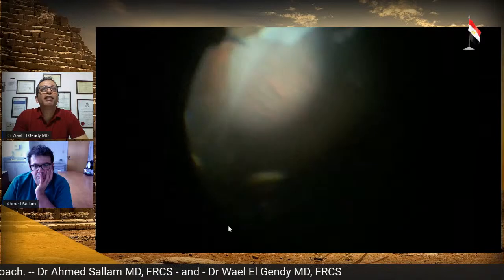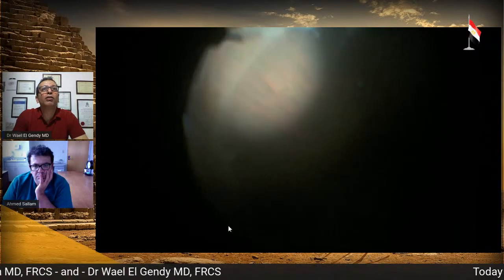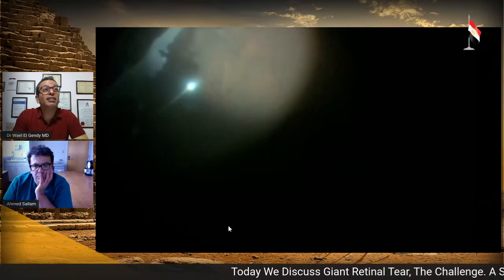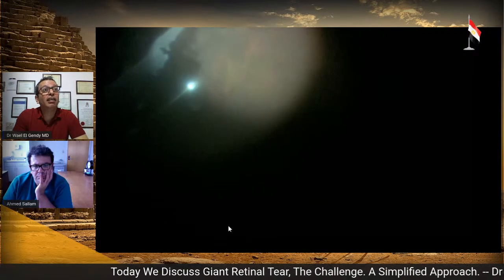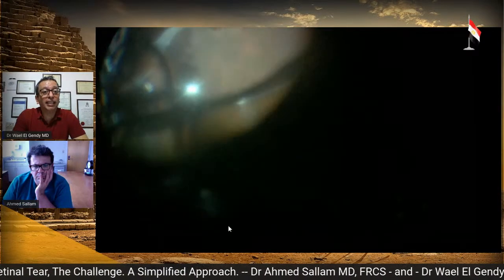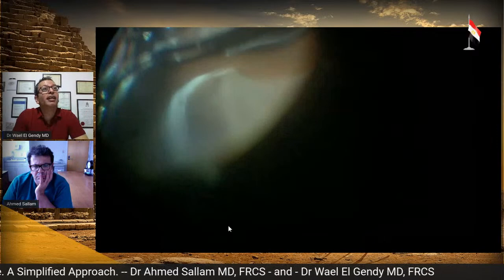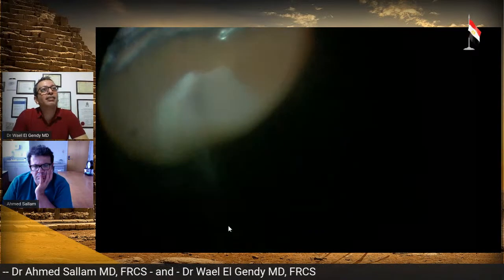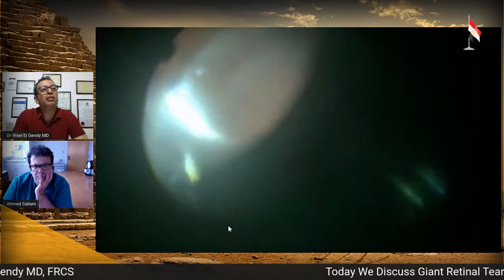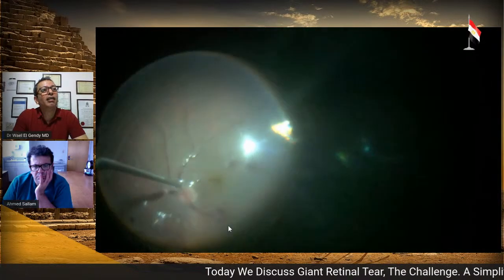Trimming of the edges of the rolled over retina. And then the retina is still not on. And still, I do PFC air exchange. That's like a big mistake. Why would you do that? So we get a huge slippage. Huge slippage. Look at this.